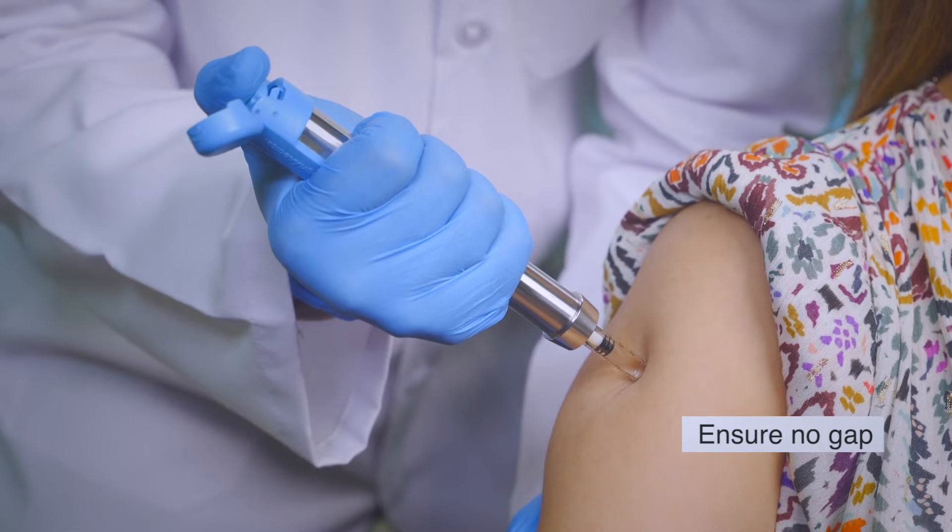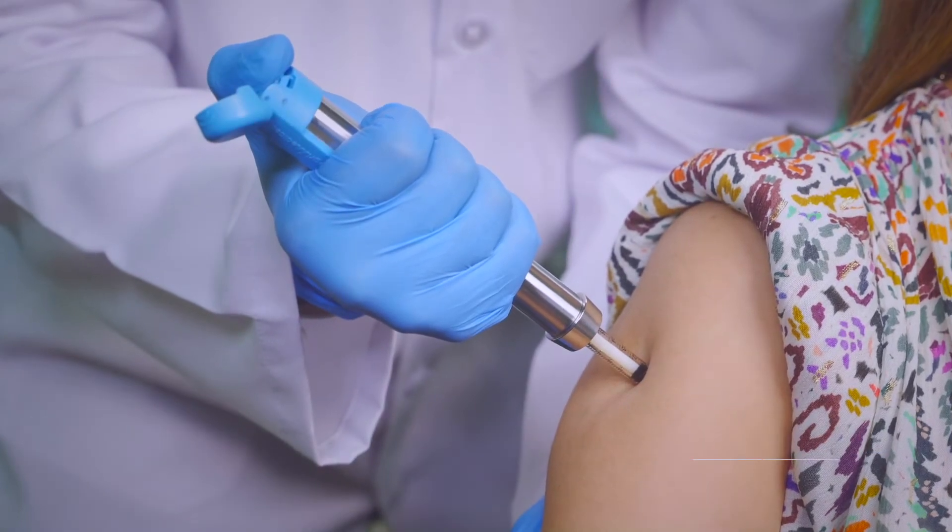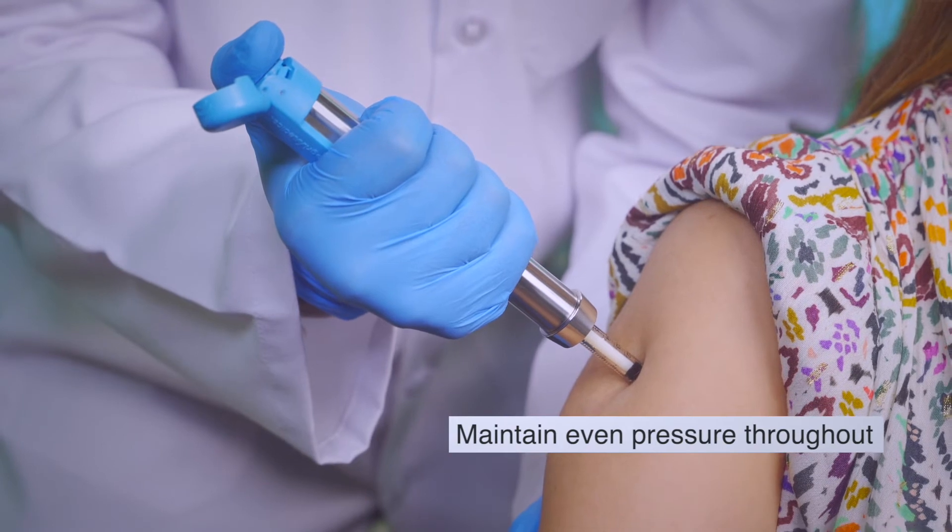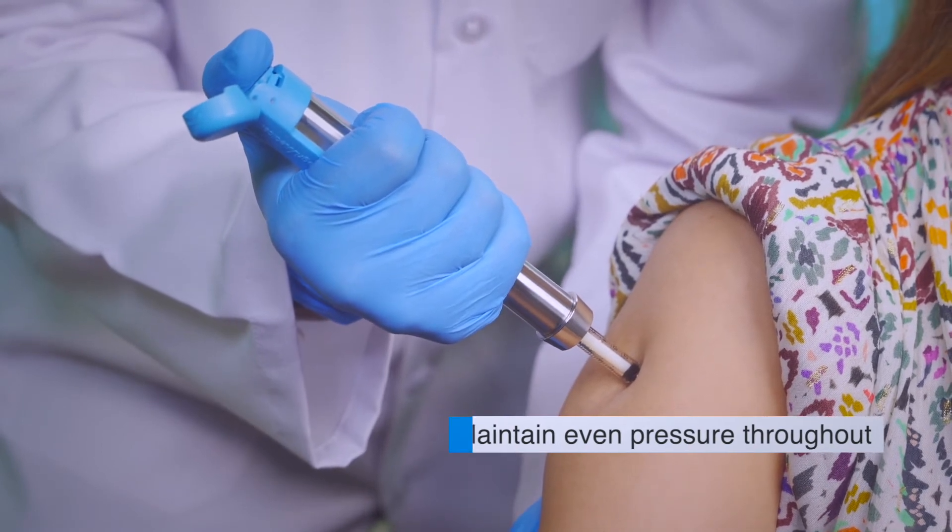Firmly press the trigger button and maintain the position until the entire medication is administered and thereafter for a few seconds.